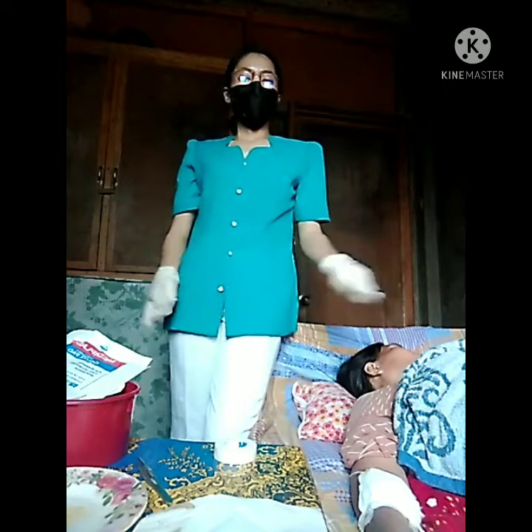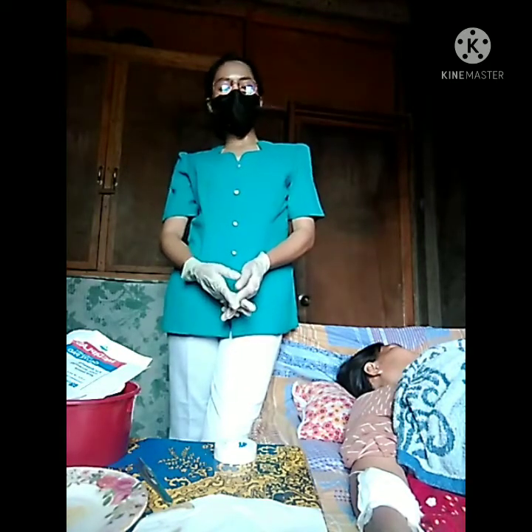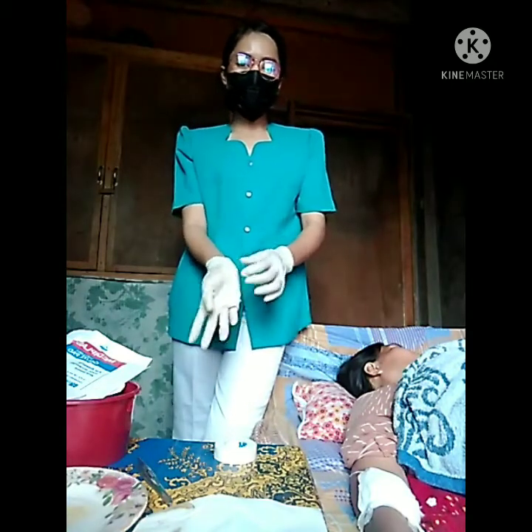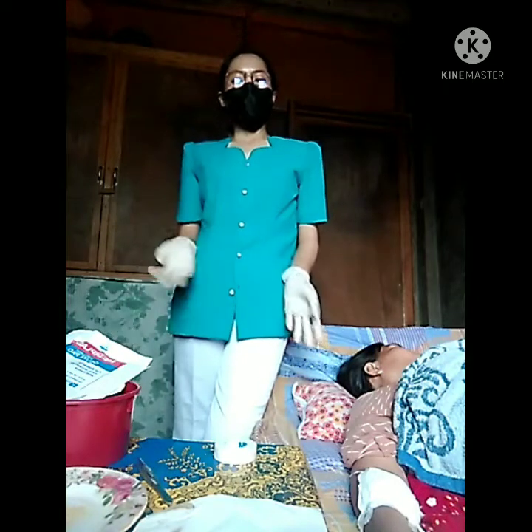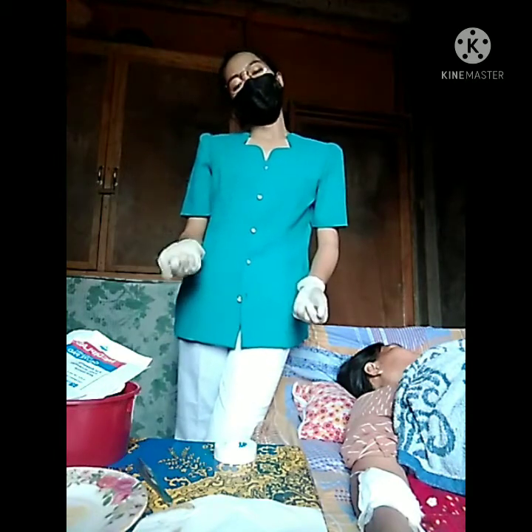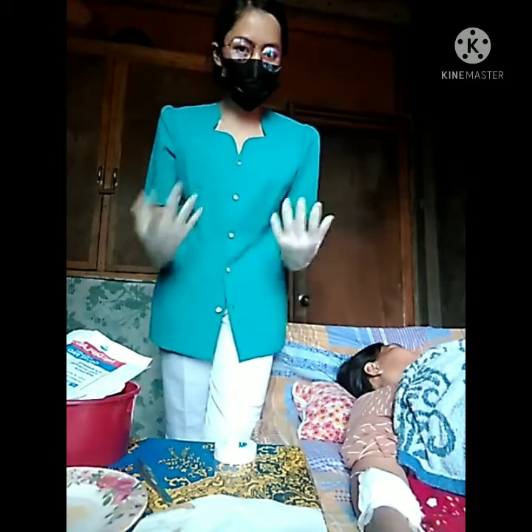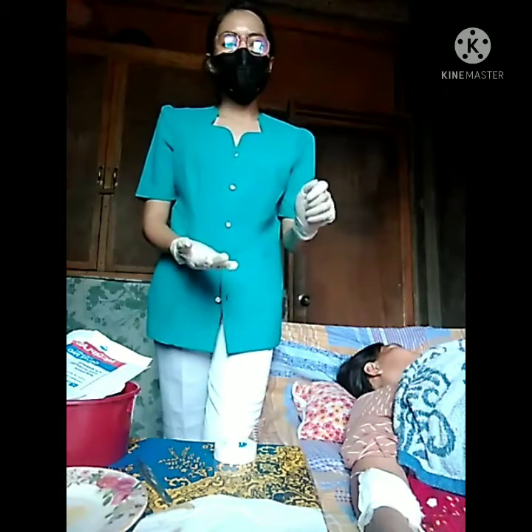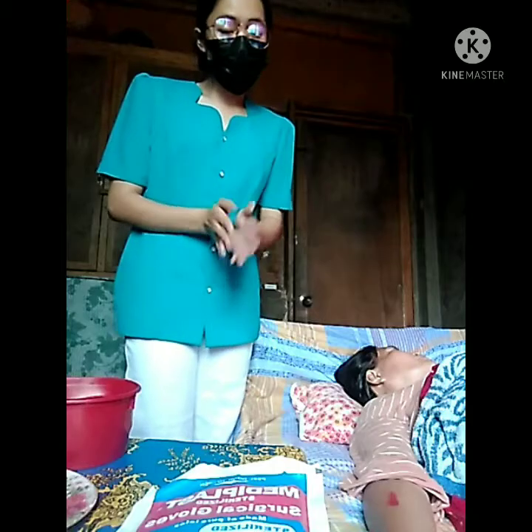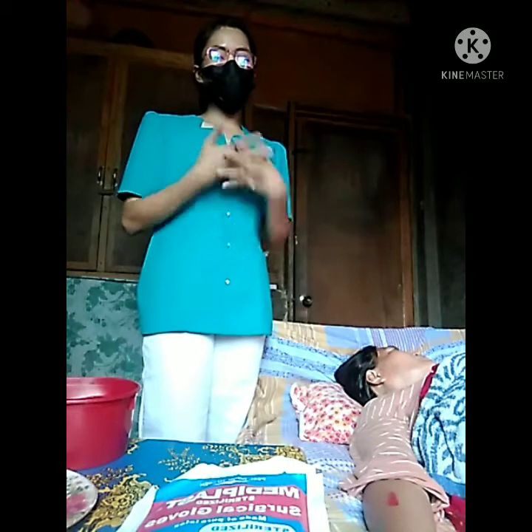So after you do the dry dressing, you will get your gloves disposed in the waste receptacle, and then clean the area after you leave, and then sanitize your hands or wash your hands, and then record your work. So after demonstrating the dry dressing, let's proceed to the wet-to-dry dressing.